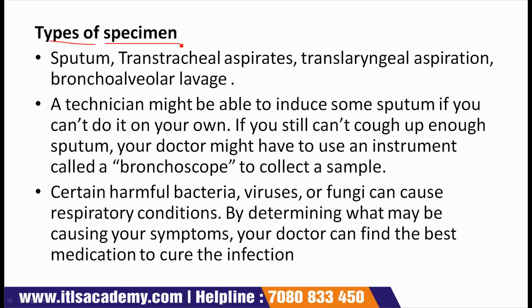Types of specimen for the sputum culture. First point is specimen is sputum. Transtracheal aspirates, translaryngeal aspirate, bronchoalveolar lavage. These are types of specimens.